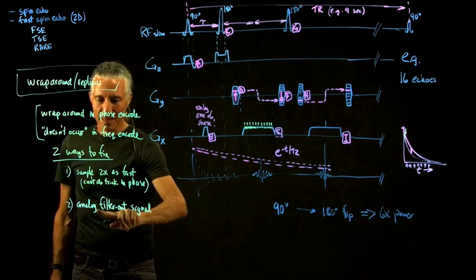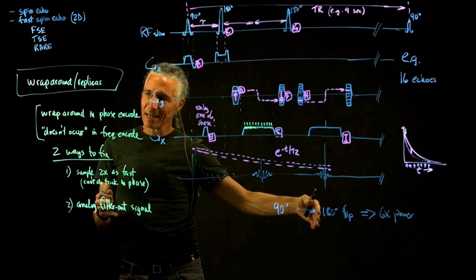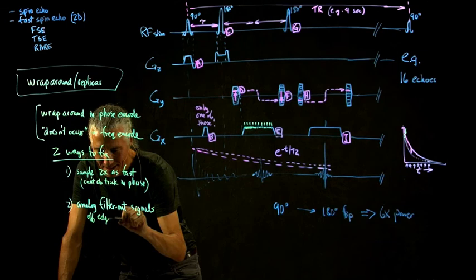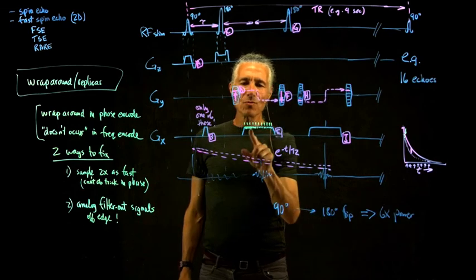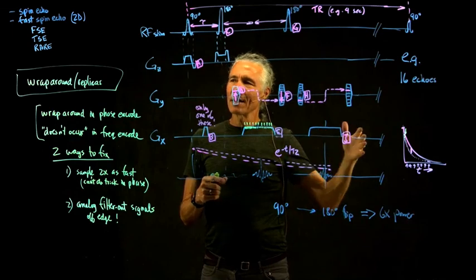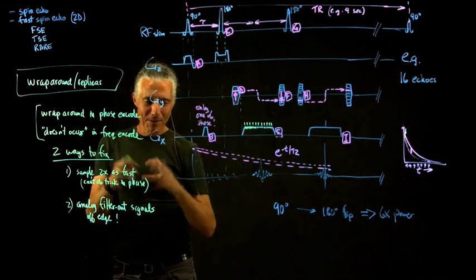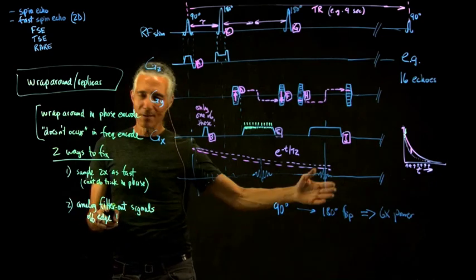And so what do those correspond to? Those correspond to parts of the brain that are off the edge, also known as wraparound. So you can analog filter out signals off the edge. What that will do is essentially remove the replicas that were off the edge of the field of view that we want to look at. If you can understand this, it's a weird twisting of ideas, because here you're going back to the spectroscopy picture to filter out these things that are off the edge.